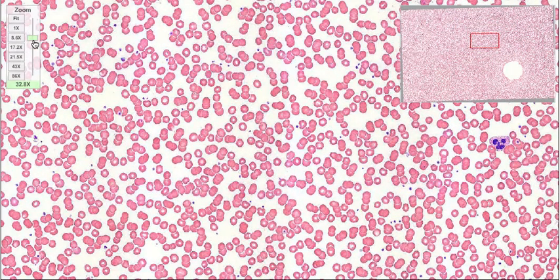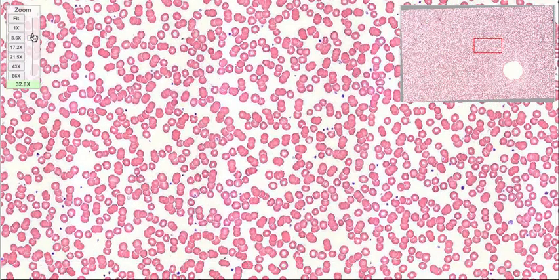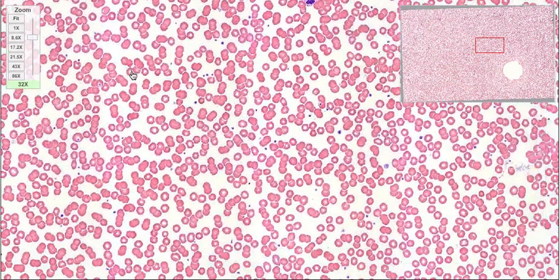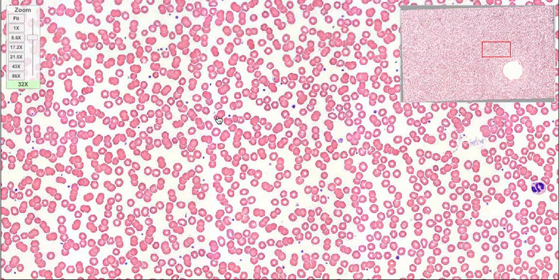So the red blood cell, or the erythrocyte, is a major component of the blood. These contain no nucleus. When they're in the developing stages of the cell, they actually chuck out the nucleus to make room for hemoglobin. And as you know, hemoglobin is a major component within red blood cells that binds oxygen, travels around in the blood and releases it to our tissues.